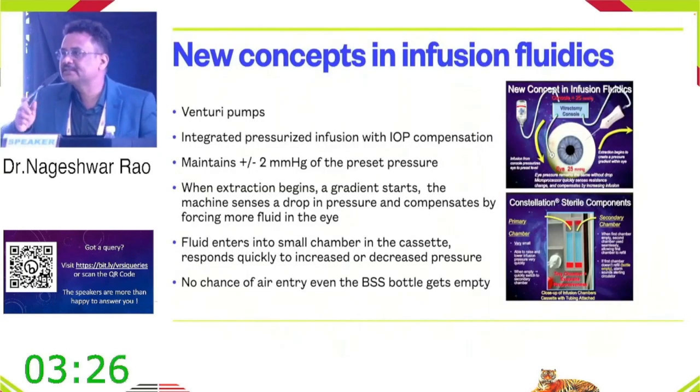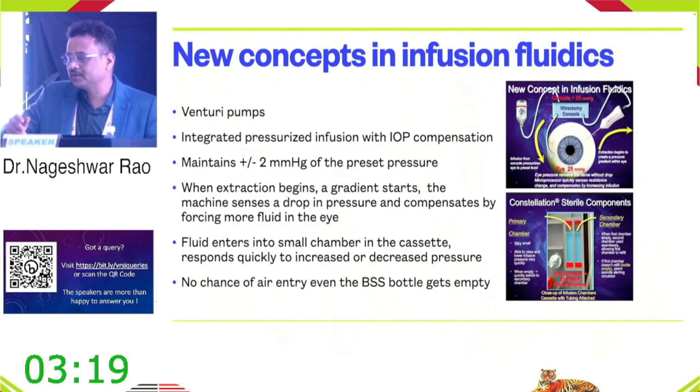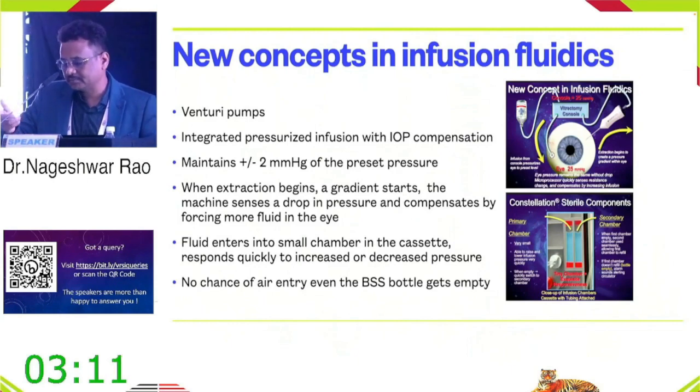The pump system: nowadays almost all the machines use the venturi system. Peristaltic has almost gone. Some machines combine the two. The venturi system lets you work at high suction.